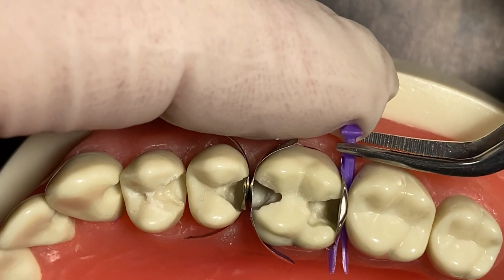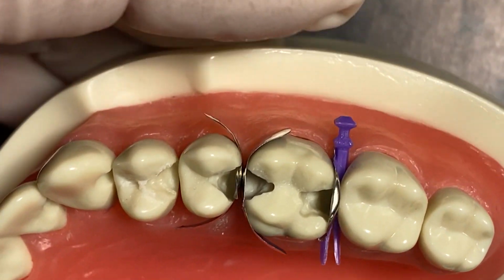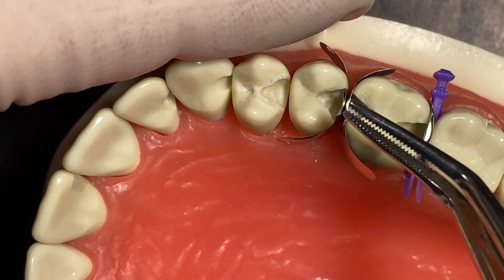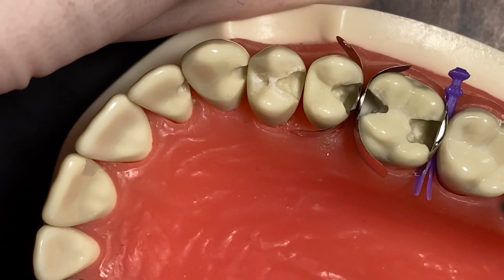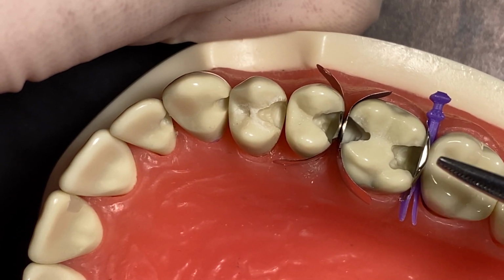What this is going to do is free up a lot of the area here and here for your ring and your sectional to focus on this kissing contact here on the adjacent class 2s, which is important. You don't have to worry about this little area back here anymore.